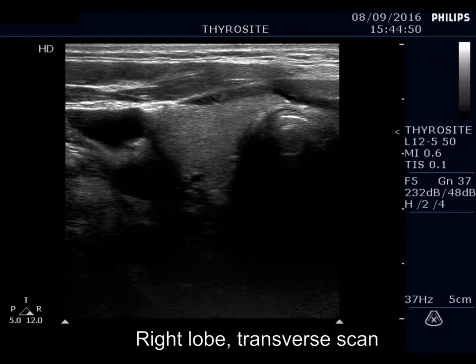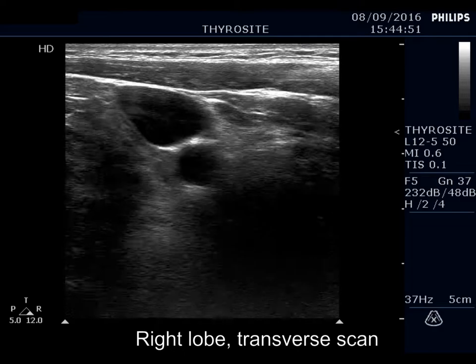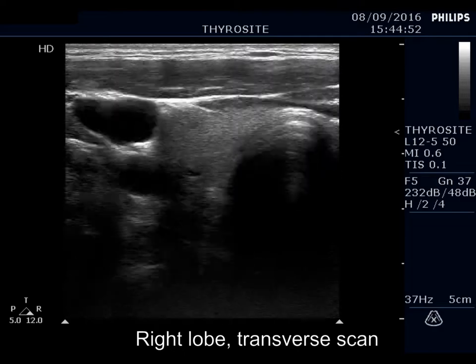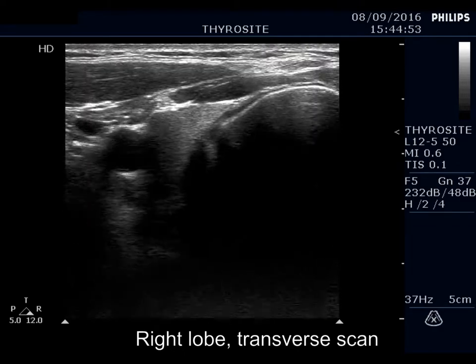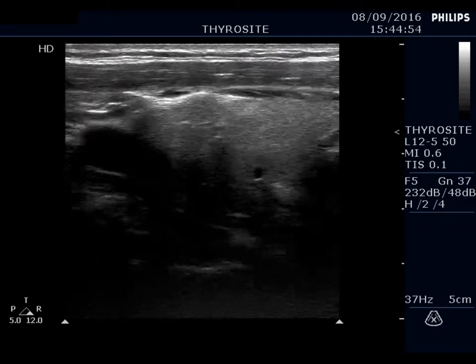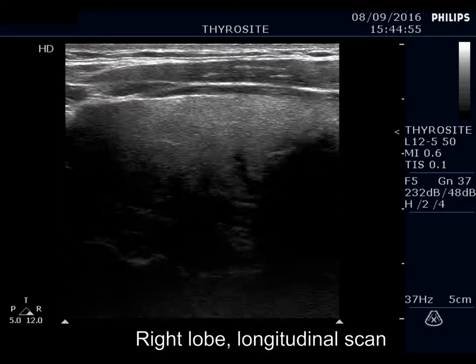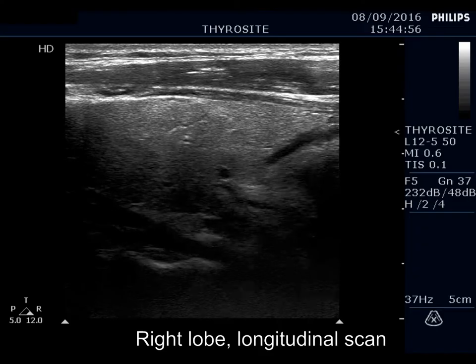The right lobe is ecnormal. There are hypoechoic areas in the dorsal part of the lobe due to the improper setting of the focus.